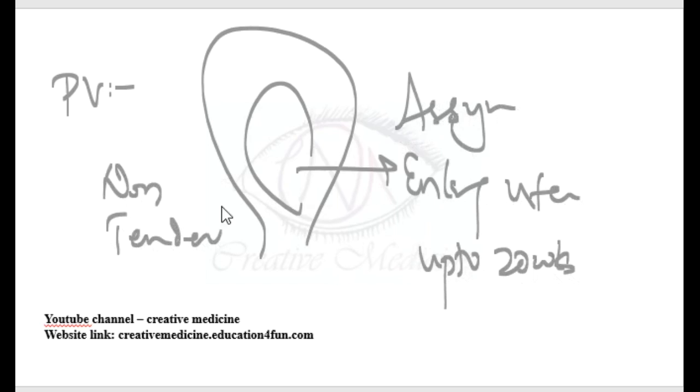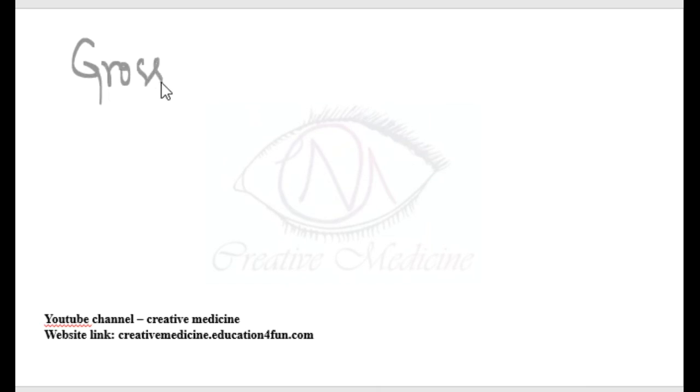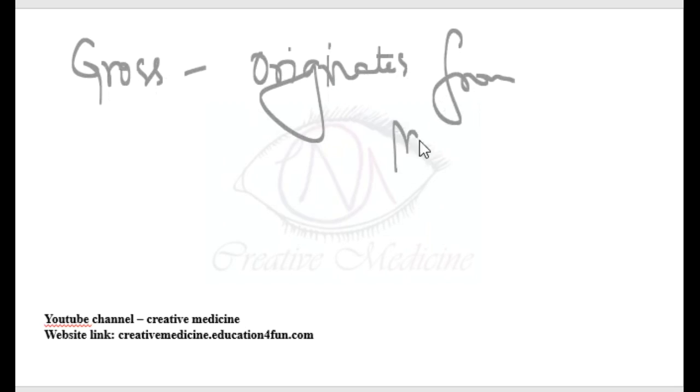First investigation in a fibroid is transvaginal ultrasonography. Investigation of choice for fibroids is transvaginal ultrasonography. Gross appearance depends on origin, and it originates from the myometrium.